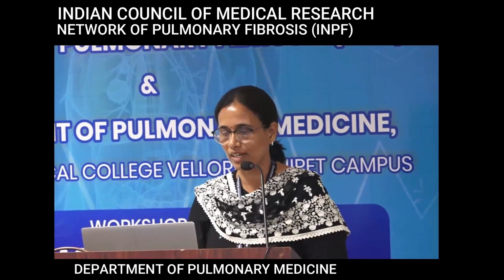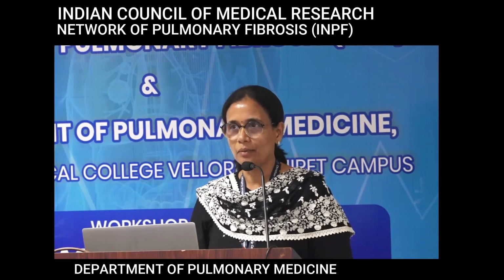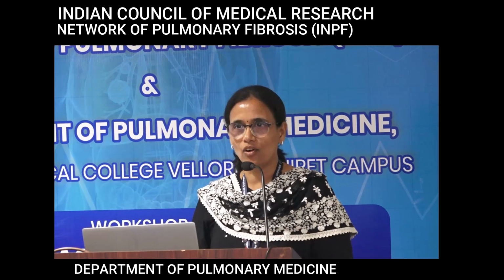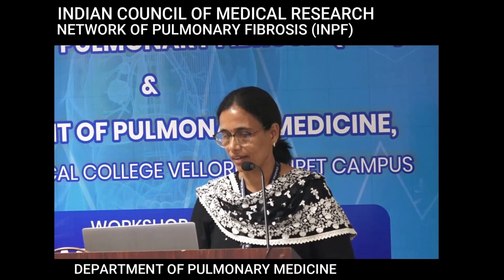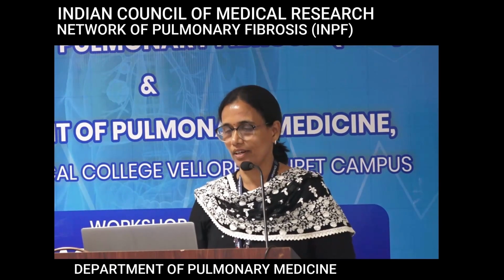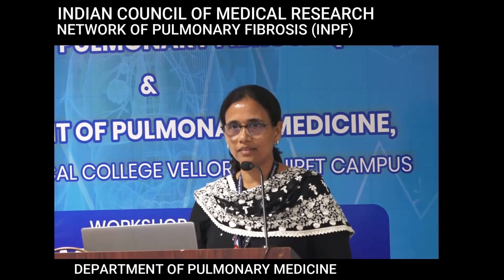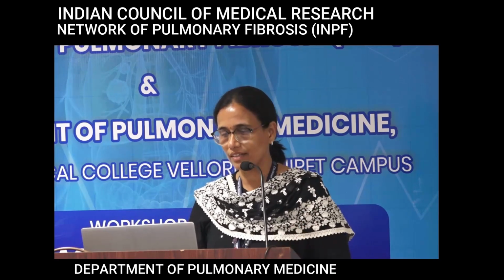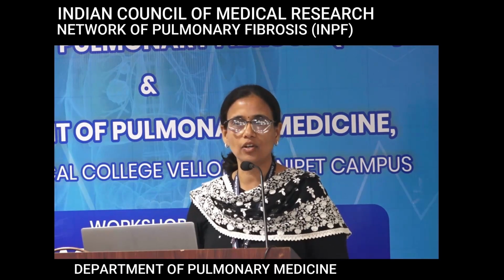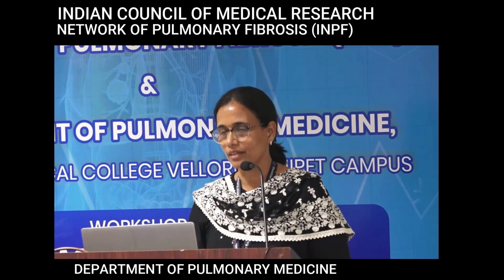How do we say fibrosis? We'll come to it. We use the term pattern in radiology or pathology because we don't know the whole picture. Only after we make sure that there's no underlying cause do we come to the diagnosis of IPF. So it's better to use the terms UIP pattern or NSIP pattern, to say that we are describing the HRCT findings and not actually the clinical syndrome. UIP pattern can be seen in many conditions, including CTD-ILDs. Even in hypersensitivity, you can get a UIP-like pattern.